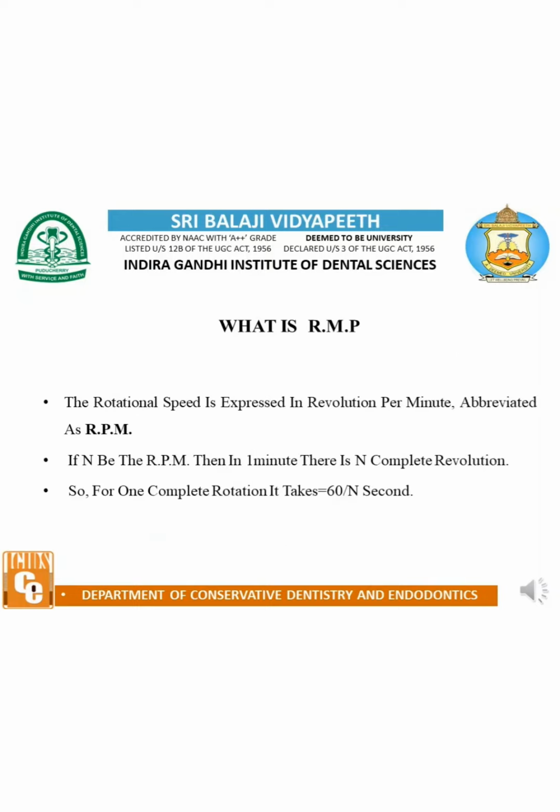What is RPM? The rotational speed is expressed in revolutions per minute, abbreviated as RPM. If n be the RPM, then in 1 minute there are n complete revolutions. For one complete rotation, it takes 60 by n seconds.